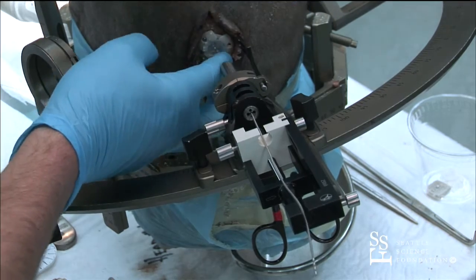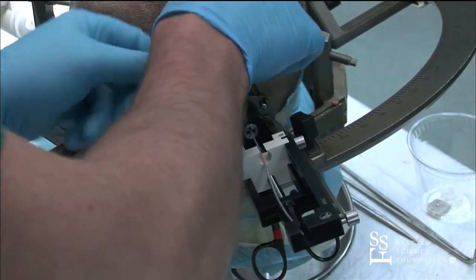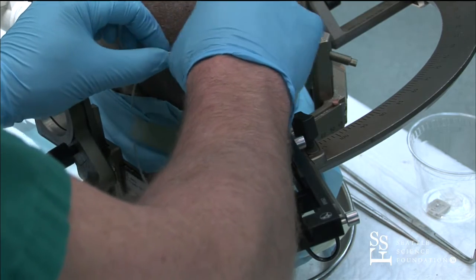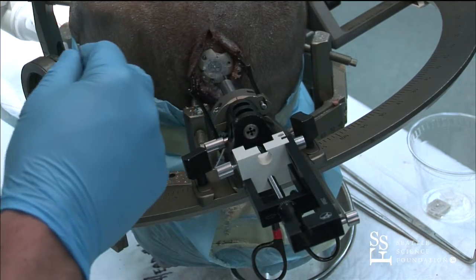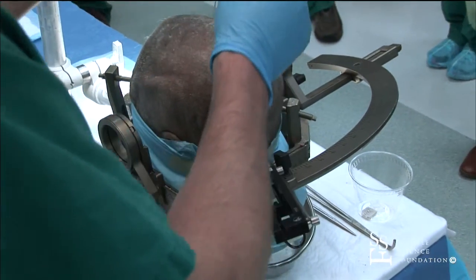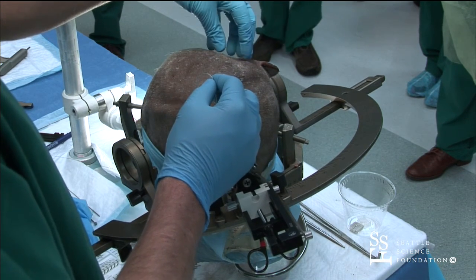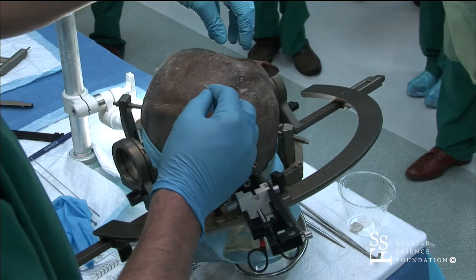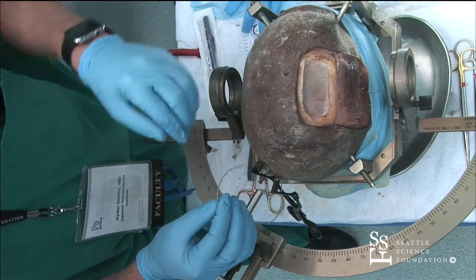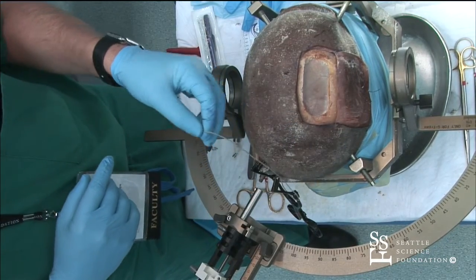So, and that's it. Generally you want to undermine around it as well, because just like a DBS electrode, there's usually some extra electrode, and you're either going to have to put it back here, or put it by the IPG. But you're going to be coming back to replace IPGs in the future, and so you want to have this as clean as possible. When you're picking the site for this, you want to have the leads go off of the device in a way that you're not going to be cutting over any electrodes in the future, okay?